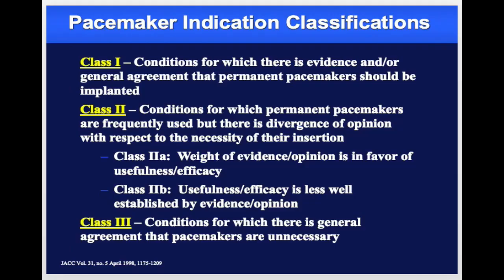The pacemaker indications are classified in many ways. In suitable patients, permanent pacing helps relieve symptoms by restoring a healthy rhythm and improving cardiac output. It may also prevent the emergence of dangerous ventricular arrhythmias that result from bradycardia. The decision to implant a permanent pacemaker is based on the classification of patient symptoms and cardiac disease states. Guidelines are set by ACC, AHA, and HRS. Pacing is indicated only when symptoms correlate with changes in the ECG.